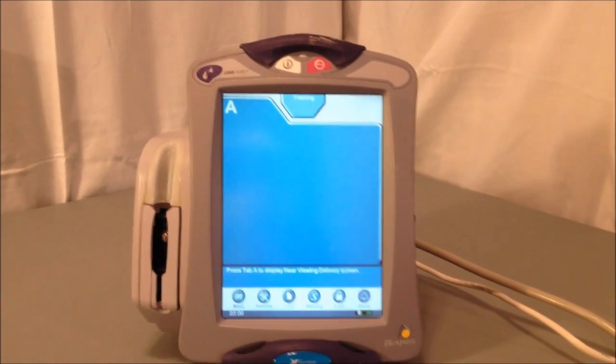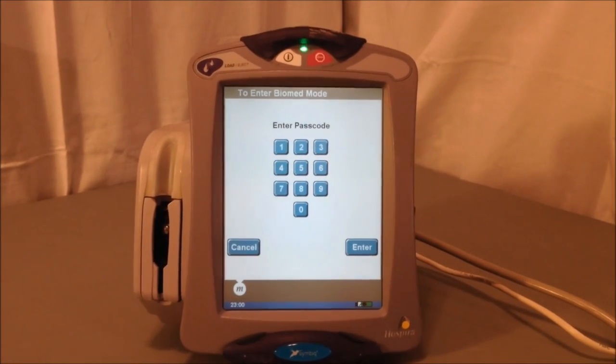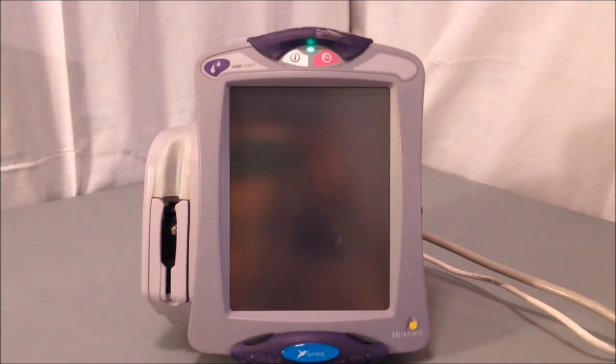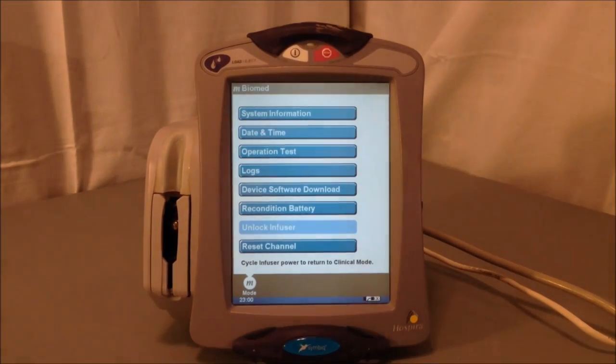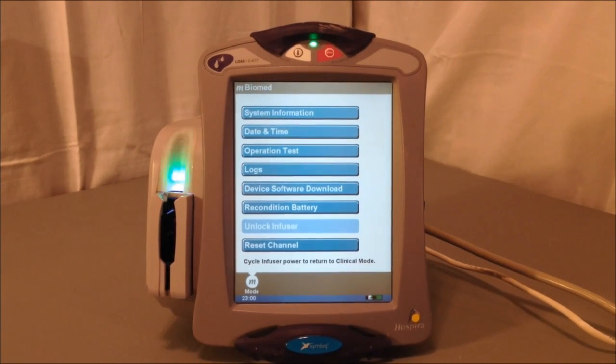I'm actually going to show you a video that shows you the dangers of connecting your user interface to your Ethernet jack or your communications module. What this is doing is essentially driving the user interface button presses from the network, right? And this is what the FDA saw when they issued their cybersecurity safety advisory for this particular pump. They advised that this pump should basically not be used in hospitals anymore.